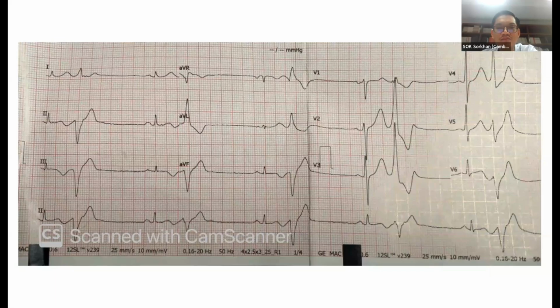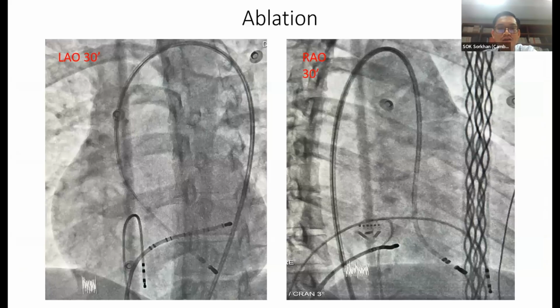So we explained to the patient again about doing ablation with the 3D map, and this time we had a 3D mapping technician. So we did it with the 3D mapping system, but we changed the strategy a bit. Before, we used the transseptal approach, and we thought our catheter was a bit unstable because of the mitral valve prolapse.